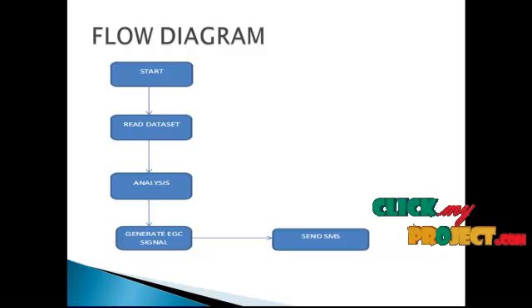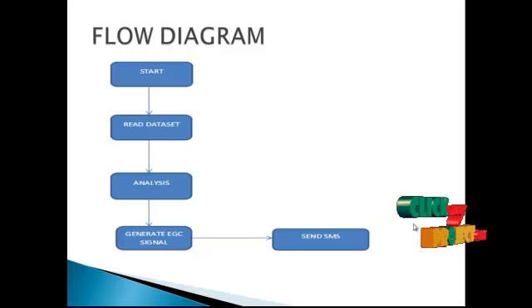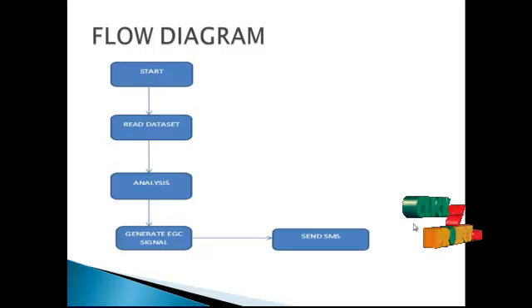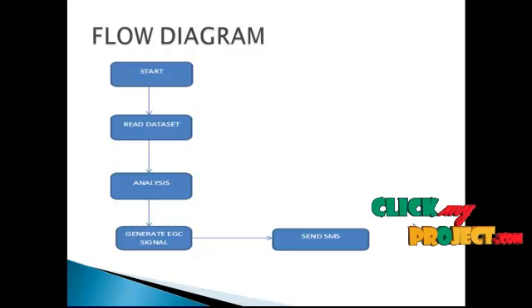After that, the ECG wave can be periodically sent to the doctor's system for manual analysis. This ECG wave will be sent over the internet after a specified time or at the doctor's request, or even the patient can send it.